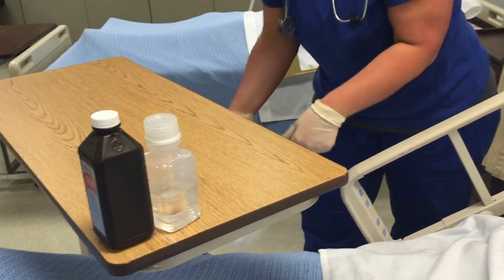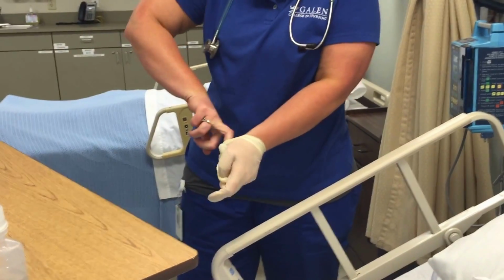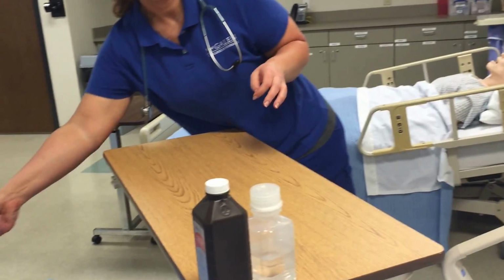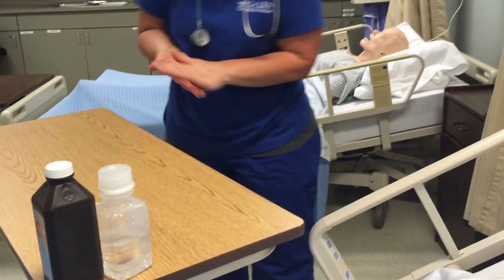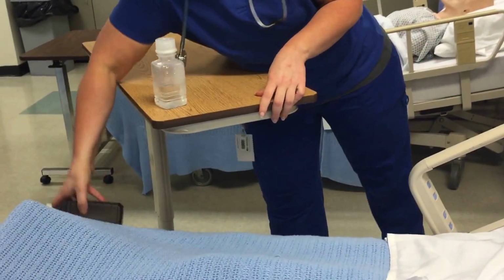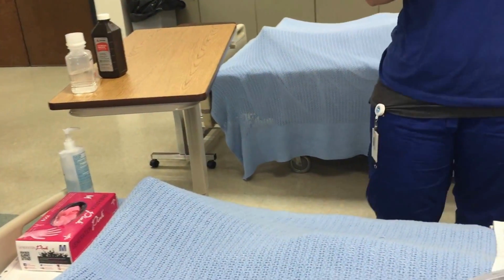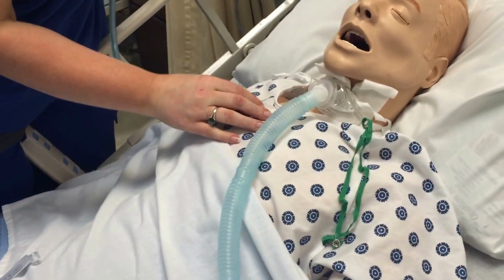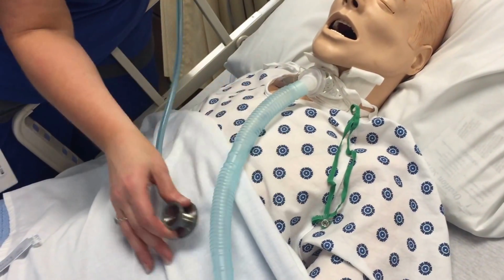Alrighty. You doing okay? Good thing to put the lid back on. I'll do one more time before I walk out the door. Never be too sure. And I'll make sure that my oxygen's back down from where I suctioned. Make sure it's back down on its normal rate of what it was supposed to be.